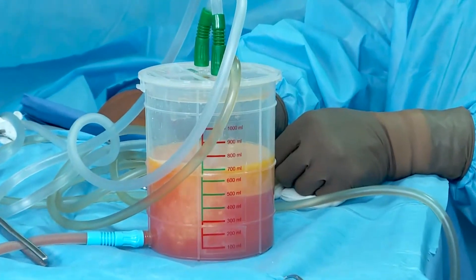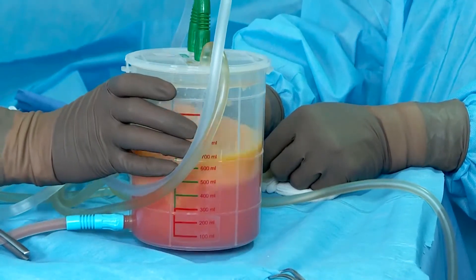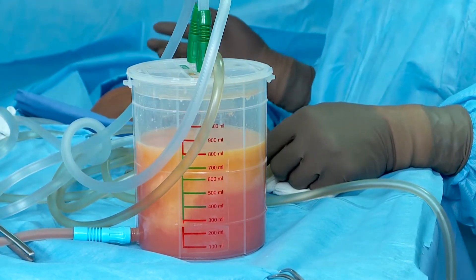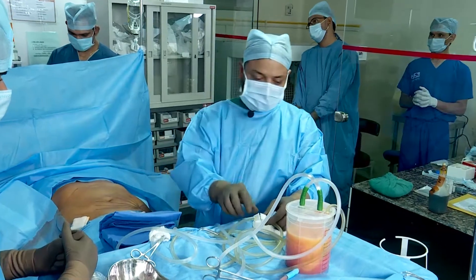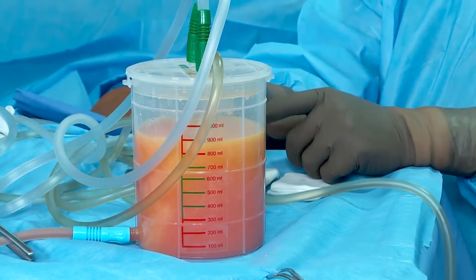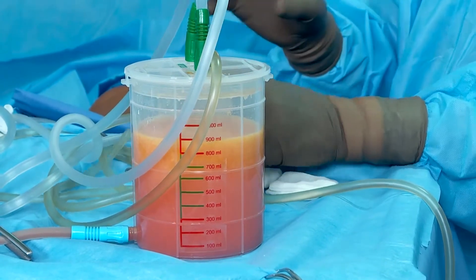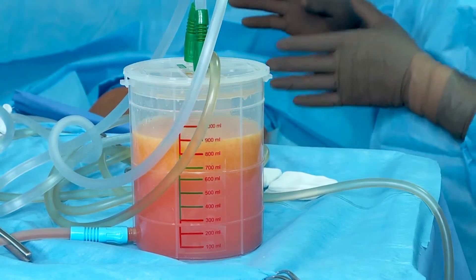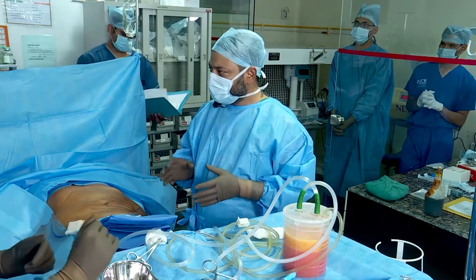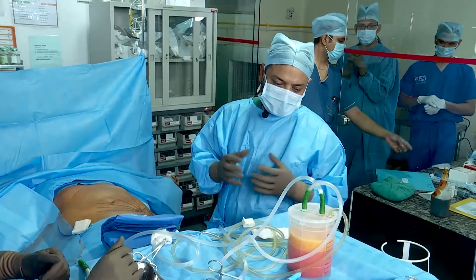The fat will always be in the upper layer and we are washing it. We need to wash out the fluid that came along with the fat. The end point is just to wash once or twice to remove excess tumescent fluid, because it contains local anesthetic. We just want to neutralize the pH of the solution to keep more cells alive.